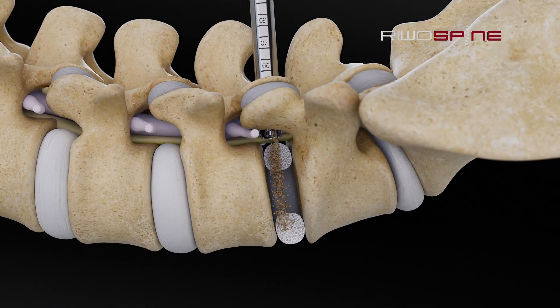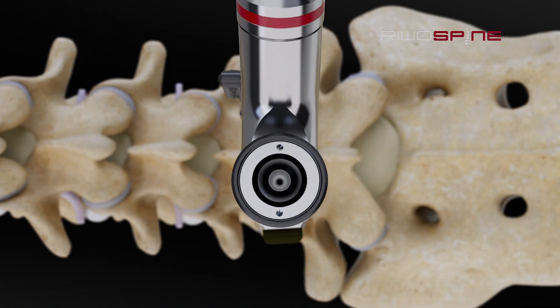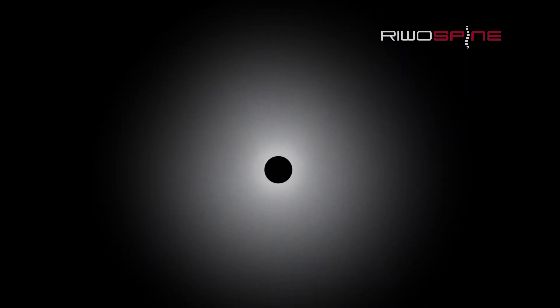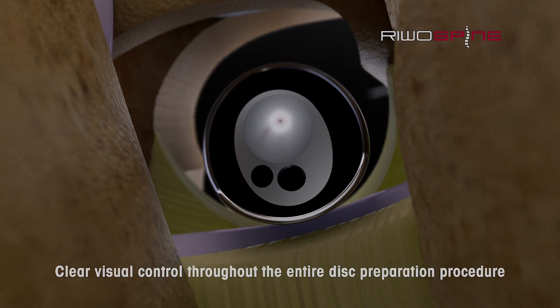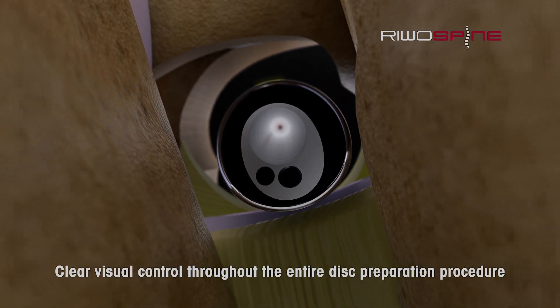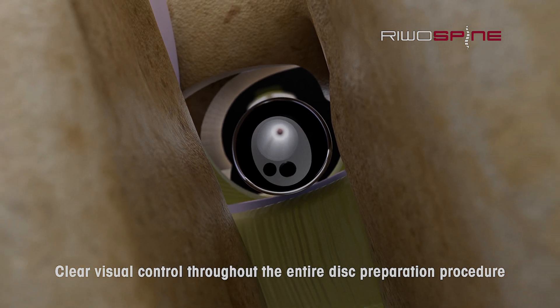For the endplate preparation, the endoscopic visual control makes a specific difference to conventional techniques. After the disc space preparation, the visual control via the endoscope gives the surgeon a complete and clear picture of the operating field. Now the surgeons can make sure that the full preparation for placing the implant is sufficient.